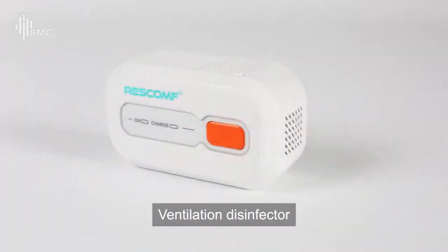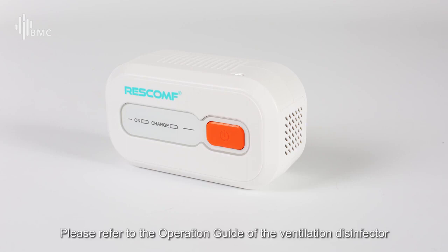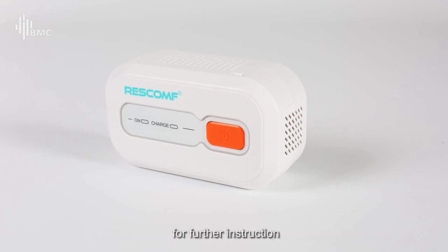Ventilation disinfector. The ventilation disinfector can disinfect the device internally to prevent bacteria from breeding. Please refer to the operation guide of the ventilation disinfector for further instruction.